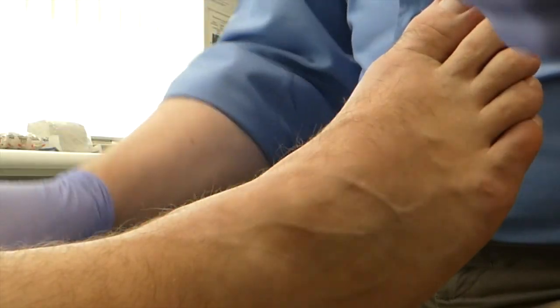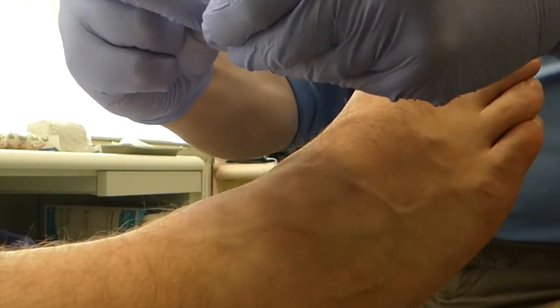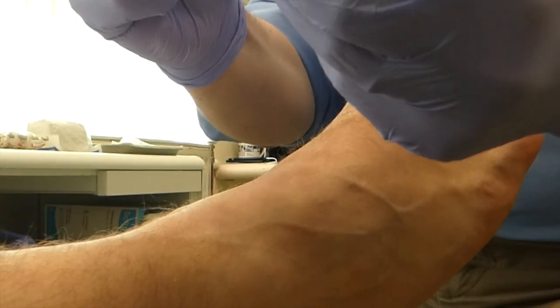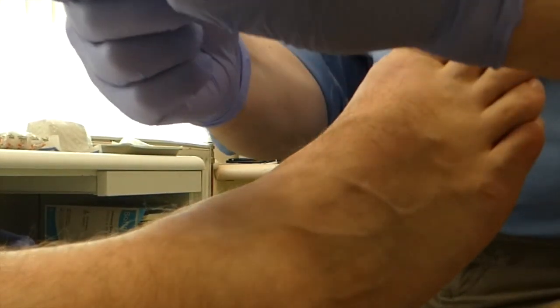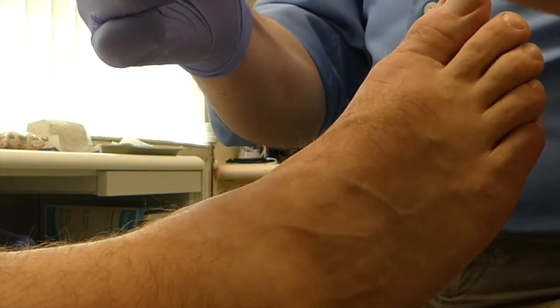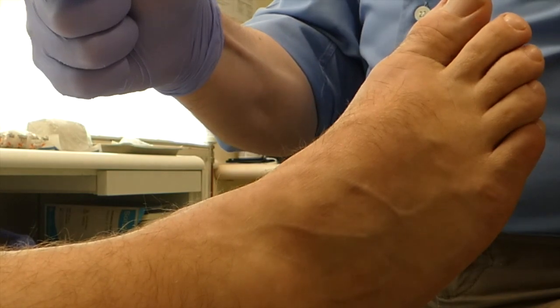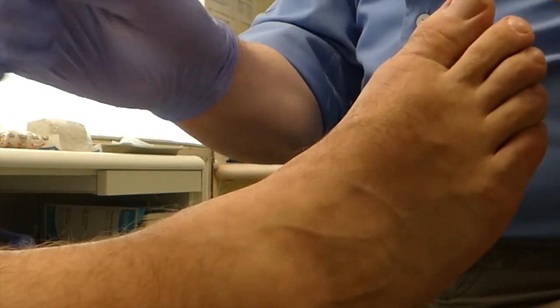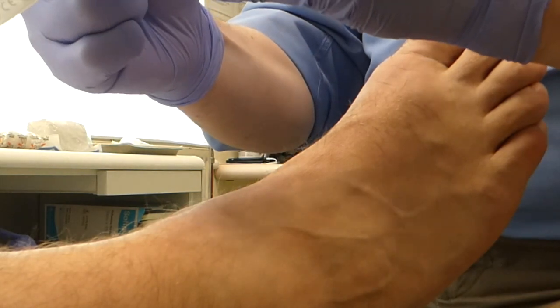Nick is going to have a cortisone injection — my favourite, good old Kenalog, Triamcinolone, first MTPJ, round about 0.4ml. Eagle-eyed viewers will notice I am using a blue needle to draw up with, because there are no green ones in the clinic today — this is an NHS day. We love the NHS. Sometimes.